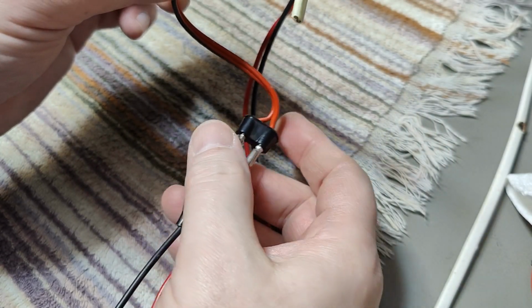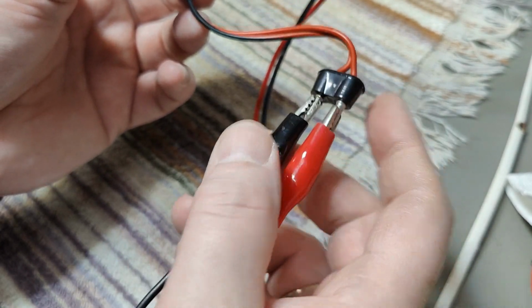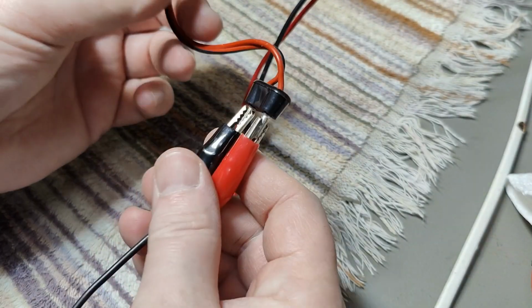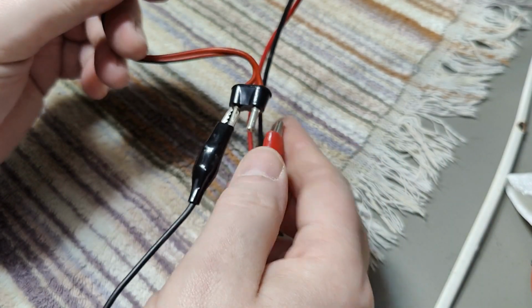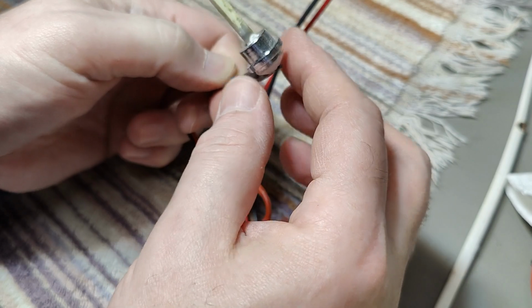Is there any? No, there's nothing. Okay, so that is why it's broken. No contact whatsoever here. Give it a few volts and there's no current. Yeah, there's definitely an open circuit. So that is why this unit was thrown out, because of the emitter.